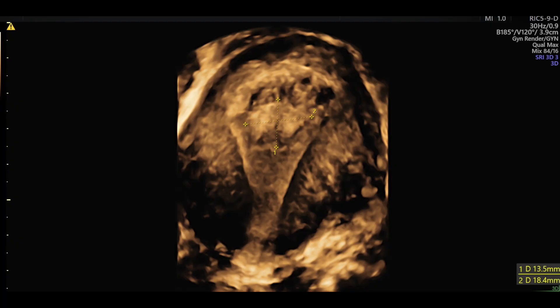This is the three-dimensional view of the uterus with an inverted triangular cavity showing retained products measuring around one and a half centimeters.